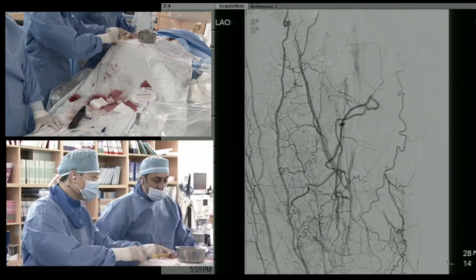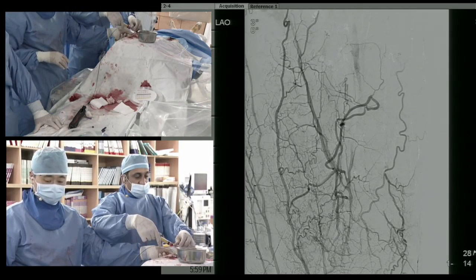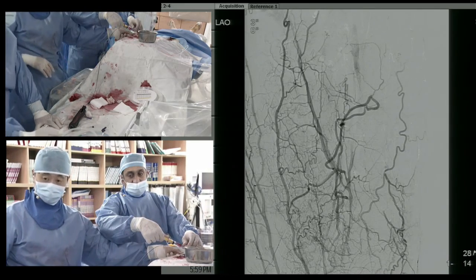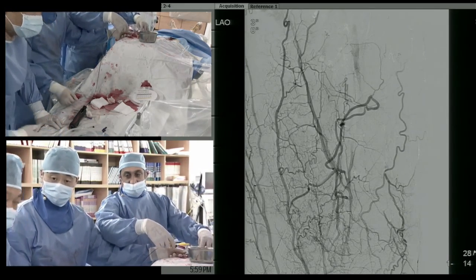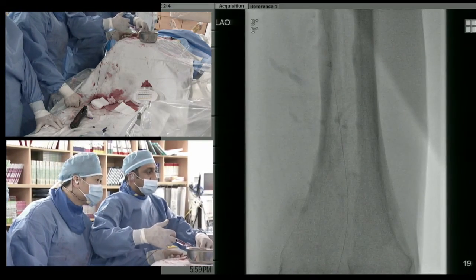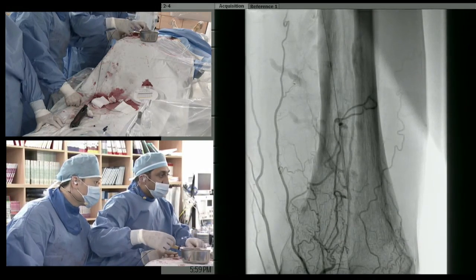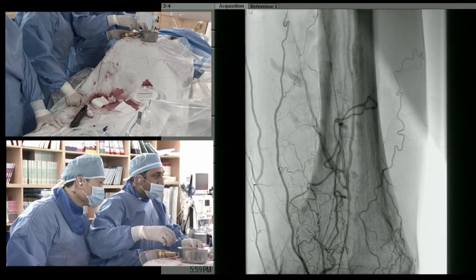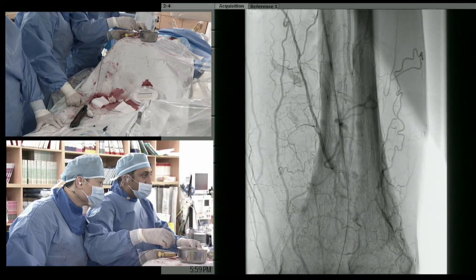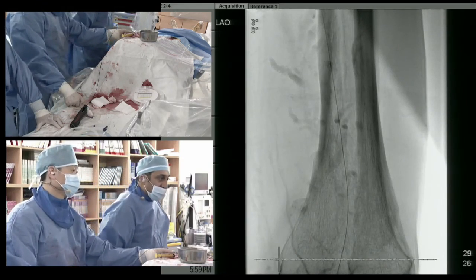So as you figure that out, Lawrence, any concerns about atherectomy in the situation where you're fairly certain that you may have been subintimal for a period prior to going into the true lumen? Any concerns about perforations in that situation? Yeah, so we've done a ton of atherectomy in CTOs, and we've had our share of complications doing it. But I don't think it's inherently risky.